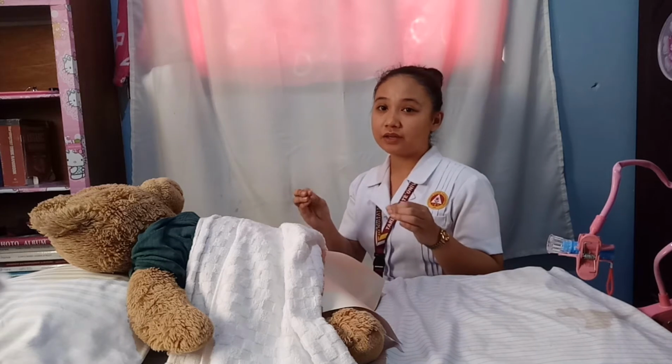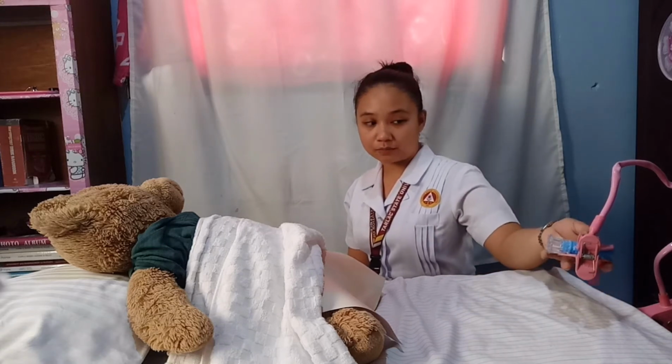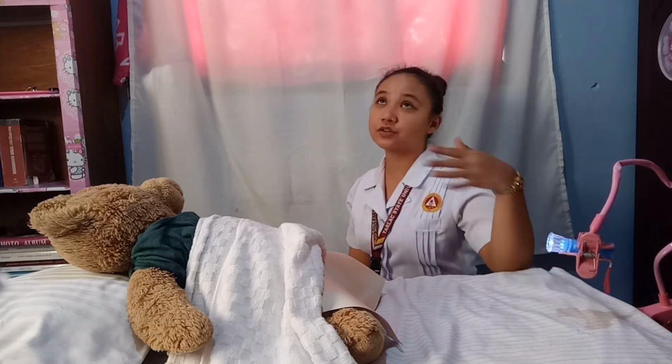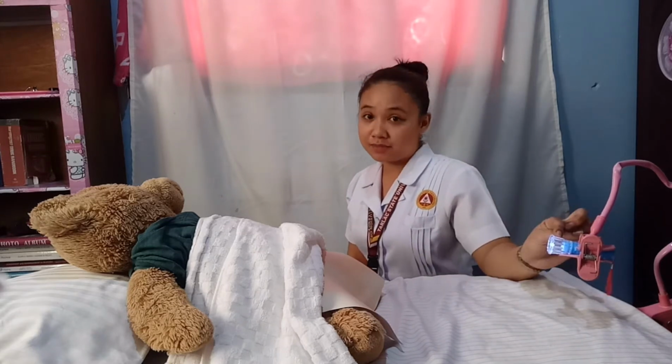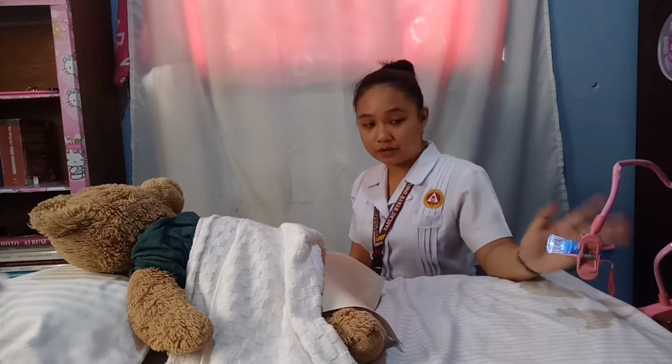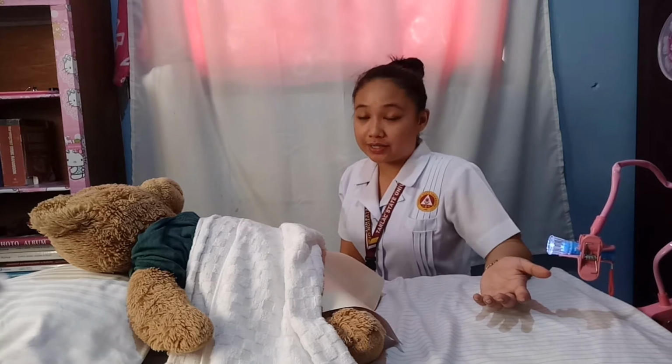After explaining everything, you need to provide adequate light. You can use an artificial light, but you can also use this perilite, and you can also use a flashlight. But by using that, you need an assistant who can hold the flashlight for you. Since I'm in my room, I have my daylight, and I also turn on the light in the room, and let's also use this. This is the perilite, or the perineal lamp.